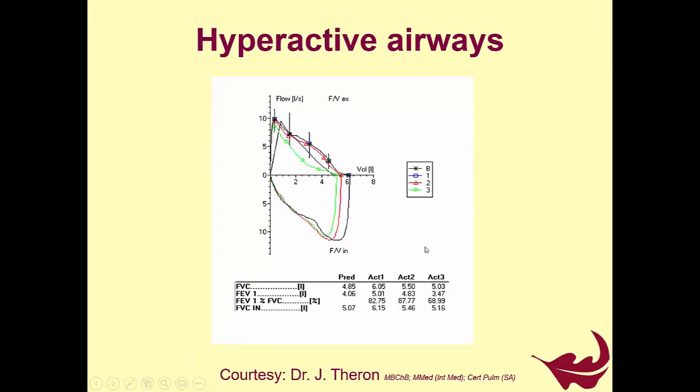Just a heads up, if you don't get reproducibility, but you see with each test, black, then blue, then red, then green, and you see that it's moving in this direction, it might be that the person is actually getting bronchospasm because of the hyperventilation. So the person is literally getting bronchospasm as a result of the test that we are doing. So then just look at a clinical examination, and obviously the person would then be unfit to dive, but would need management and further treatment and so forth. And that's not an indication to continue hunting for reproducibility. The more you test, the worse it's going to become essentially.